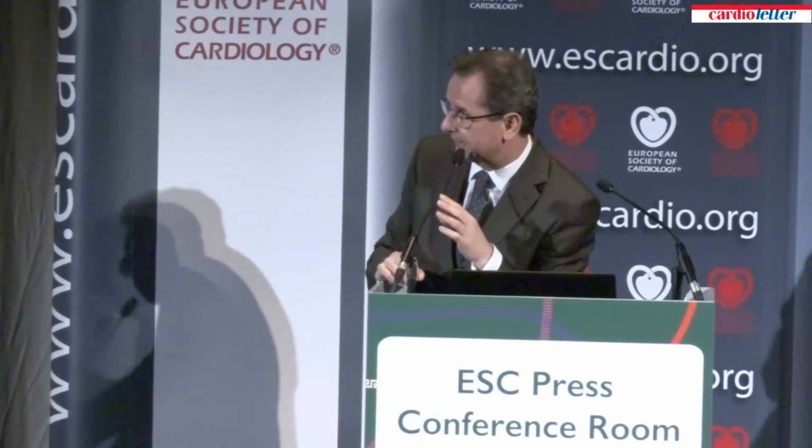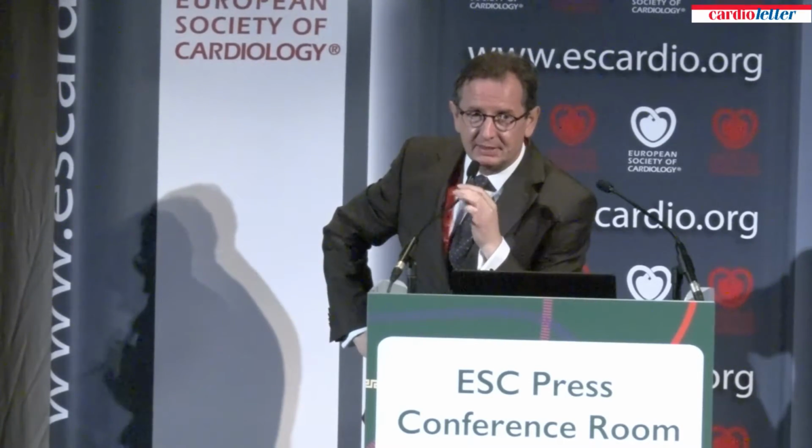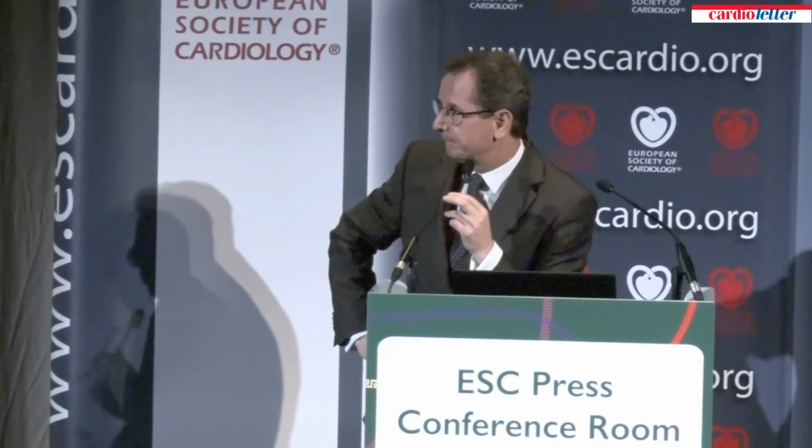In general, if you are a doctor, you should try to use both techniques, but if you are not able to do culotte stenting correctly, then I think it's still better to do tap stenting. Better a good tap stenting than a bad culotte stenting. But of course, patients are expecting the best treatment, and according to this data, if there is suitable anatomy for both approaches, you can achieve better results with culotte stenting, which is technically more challenging. But doctors should be trained in this technique. I think that is a fantastic final statement.